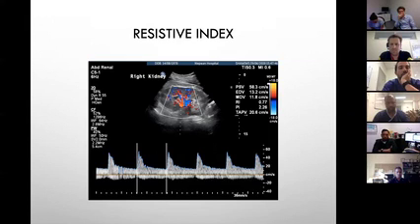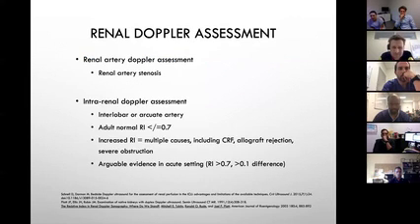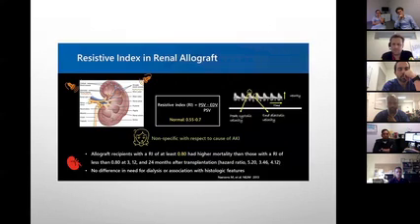So there have been values put on for hydronephrosis. Patients who have hydronephrosis will have a higher resistance and this and that, but it's not been very well validated for hydronephrosis. The only place it's of very good value, I think, is your transplanted kidneys. I think you would probably see most of those. We don't see that much in the ED setup.